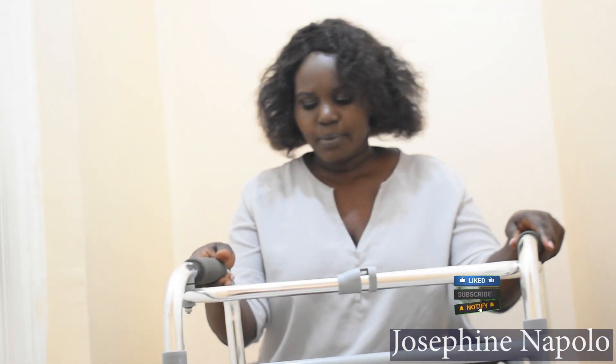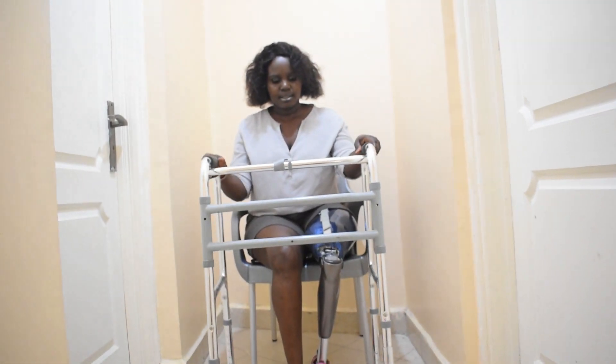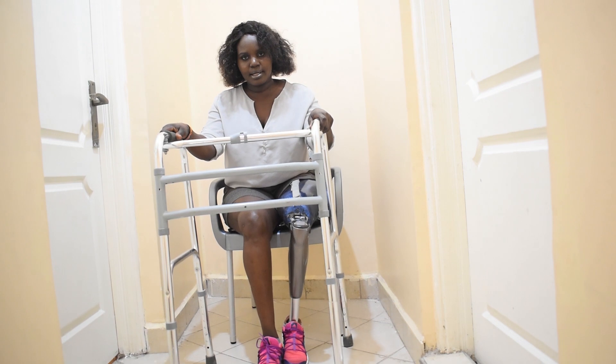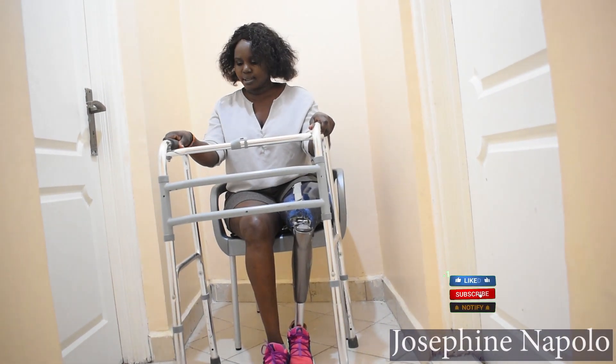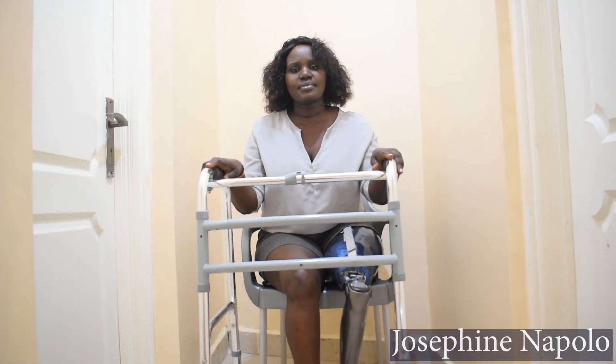Down here we have the rubber stands. It's very stable and cannot easily slip. The frame is very stable. So this is the walker.